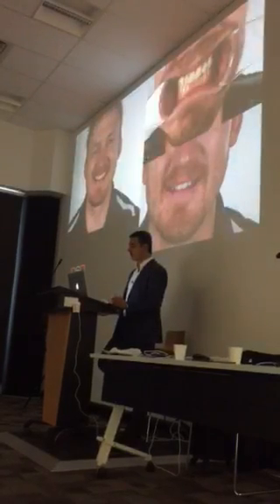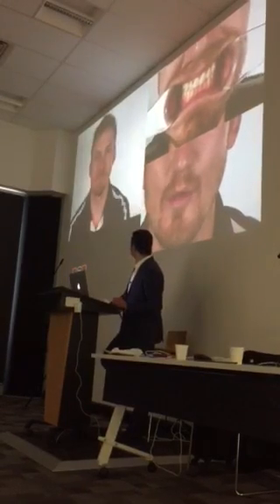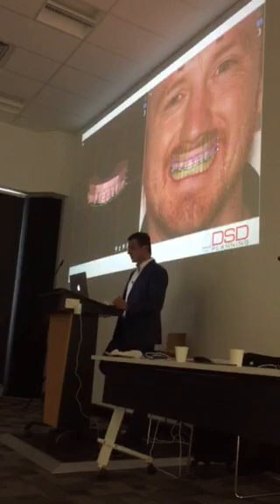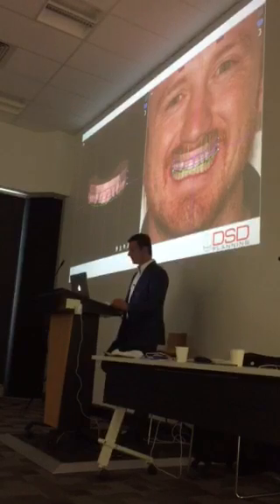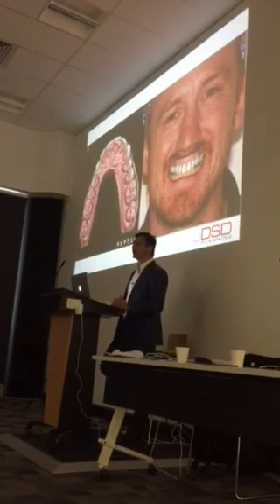We use, and we'll go through this, we use a lot of video. Count 1 to 10 for me. 1, 2, 4, done. And we'll go through that whole process. So again, using the 2D, merge it into the 3D software, ideal proportions, looking at existing gum heights, where there's minimal gum display.